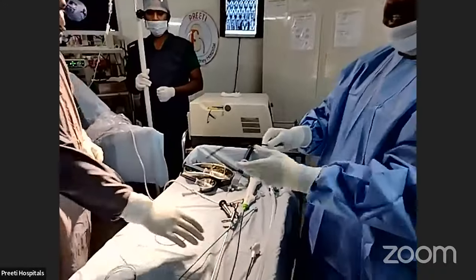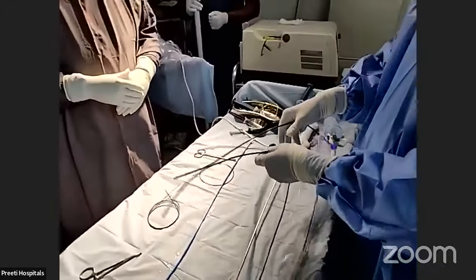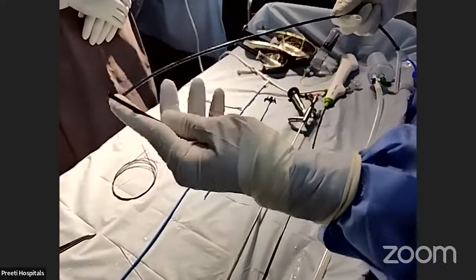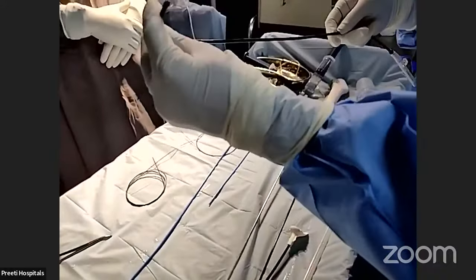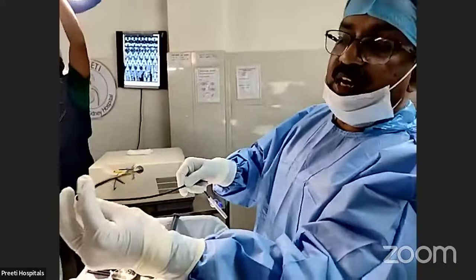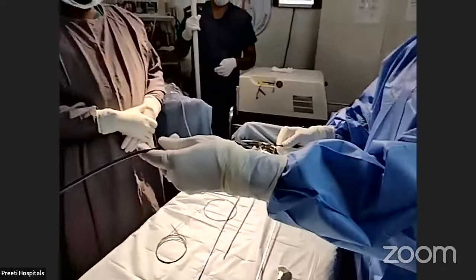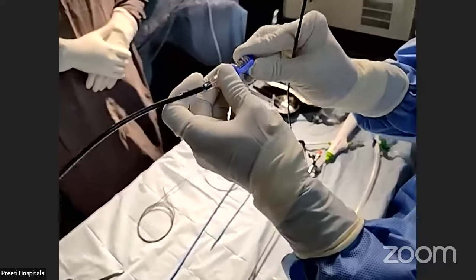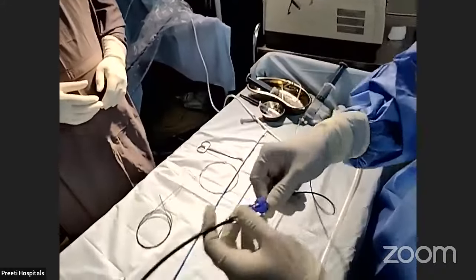like this here. This is highly flexible, see. Whereas if you take it out, if you see here, this is not flexible, whereas this is flexible. This is not flexible. See, it's rigid. There are multiple rings here. Those rings are weakened here. You can see transparently inside also small rings. So it is highly flexible. When you pass the flexible scope through this sheath, there is a connector here, which will prevent the suction leaking, this connector. And it will go inside like this.